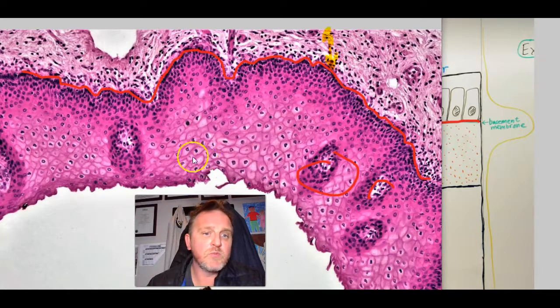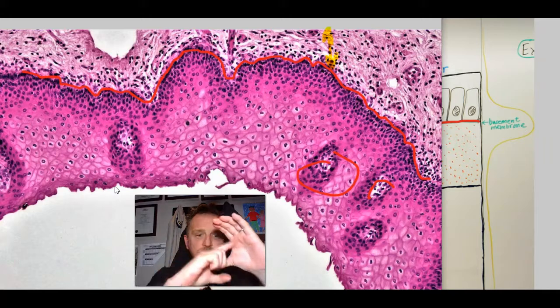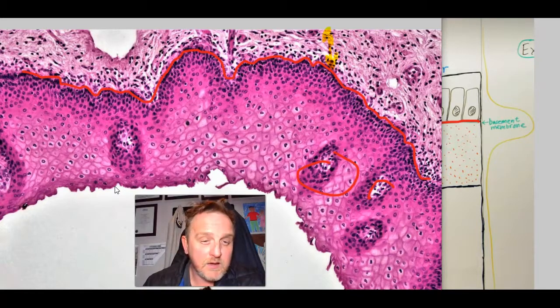Now, this would be an example of a moist epithelium because of the apical, the most superior surface. I know on our image this is to the inferior aspect of the image here at the bottom, but this is in fact the luminal aspect. So when we deal with a circular organ or a tubular organ, everything on the inner perimeter of that organ is the superficial layer, or the superior surface, to put it that way.